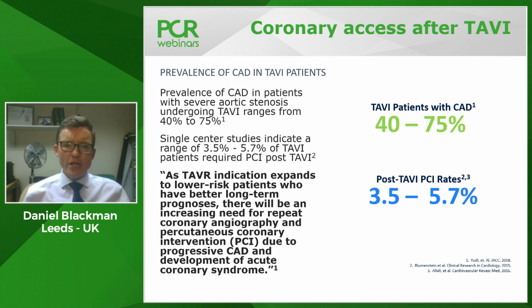But I think, as TAVI operators, we've taken a progressively more conservative approach to revascularization prior to TAVI. And certainly our approach in my center in Leeds is only to consider pre-TAVI PCI in patients who have proximal significant disease and symptoms of chest pain. And indeed, our current practice is not to perform invasive coronary angiography, but to rely on the CT angiogram to exclude significant proximal coronary artery disease.